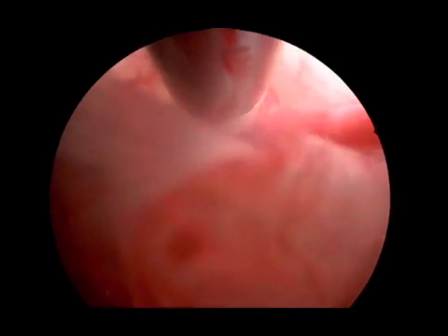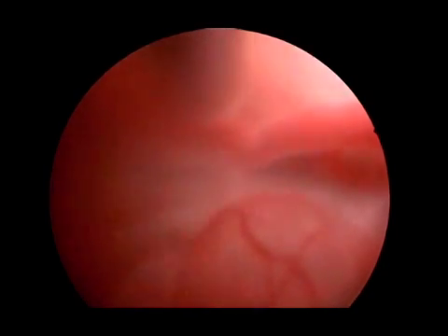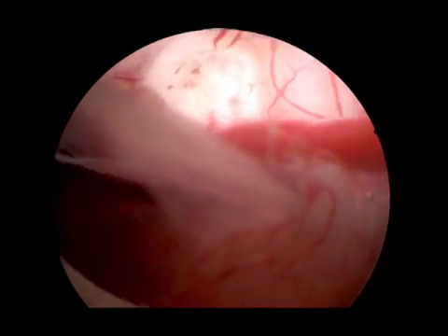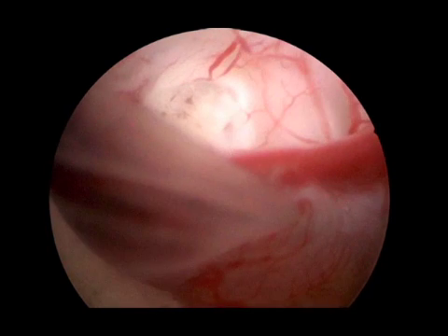With forced irrigation you can clear the view directly in front of the endoscope tip. After identifying the small perforator that was cut, compress it carefully — you do not want to coagulate the main vessel, only the small side branch. I create an artificial space within the sheath, which is very important to clear the view, because in a large cavity you cannot achieve a good view otherwise. After coagulation, hemostasis is achieved. The key point is to go very close with the sheath to the hemorrhage so the small space within the sheath can be cleared of bloody CSF — this shows how important the sheath is during certain procedures.